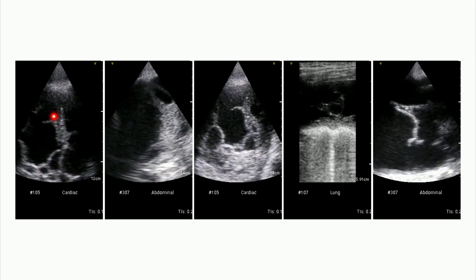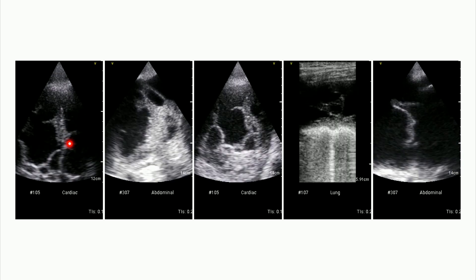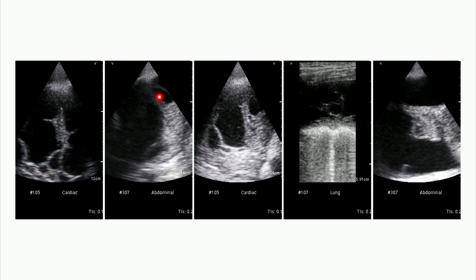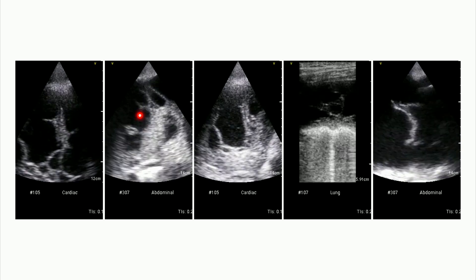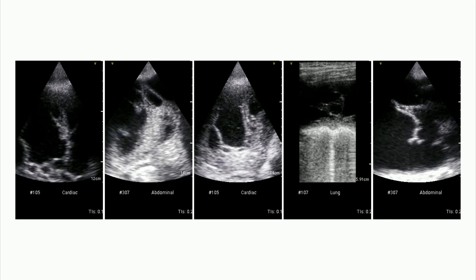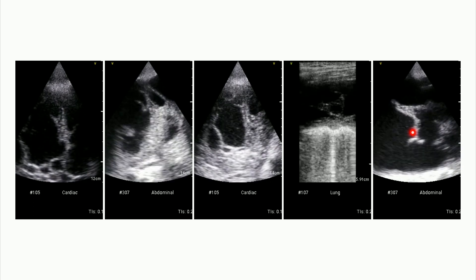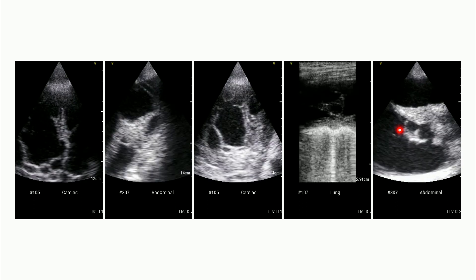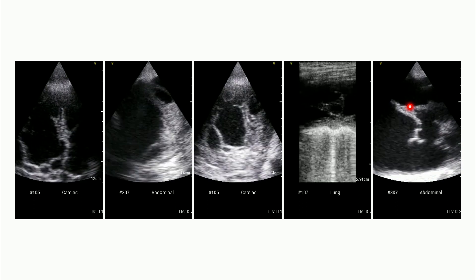Here again you can see a lot of fibrinous strands. They could appear in various shapes. Here is an example with really a whole lot of free fluid again.